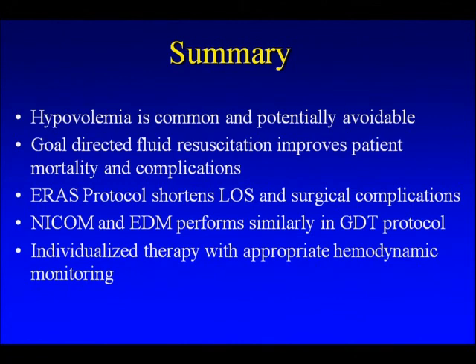The most important thing is that now we really need to individualize therapy, because every patient may be different. Their fluid status is different when they come to us. Their response may be different. And therefore, in order to really know where the patients are, it's important to have appropriate monitoring.